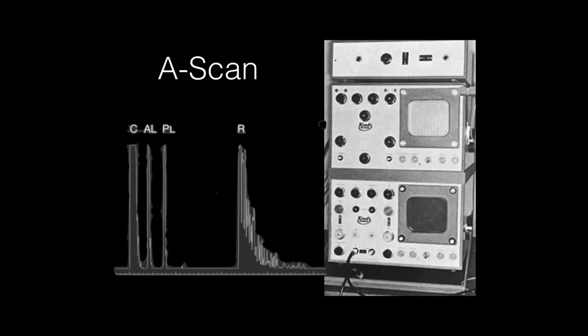Introduction. So first, a little history and background on ocular ultrasound. The first published paper on ocular ultrasound was in 1956, by Munt and Hughes. Basically they were looking at something called an A-scan, using what at that time they called a reflectoscope. An A-scan was just a single ultrasound beam that was sent from the transducer through the eye and ended up receiving back a series of spikes which are proportional to the return of the echo. So this was how early eye ultrasound was first being used.